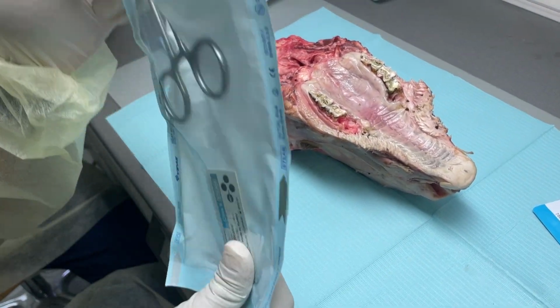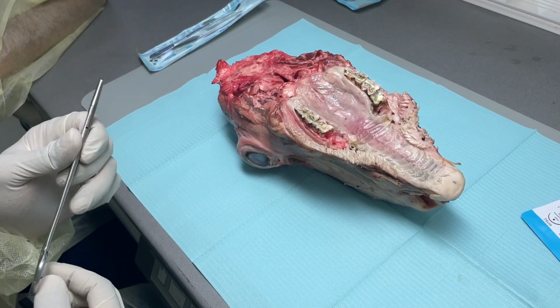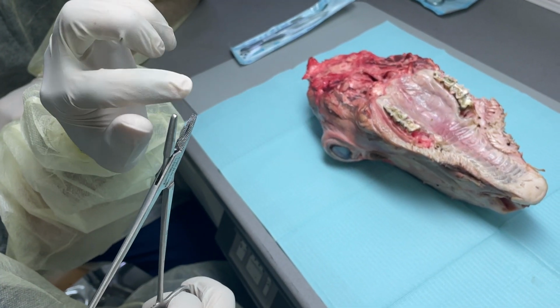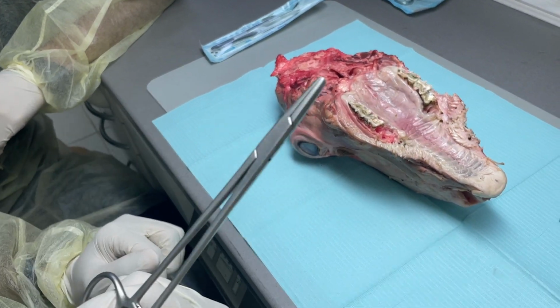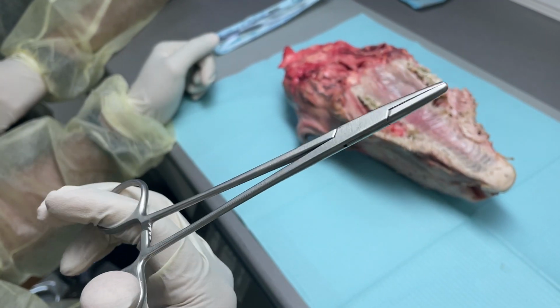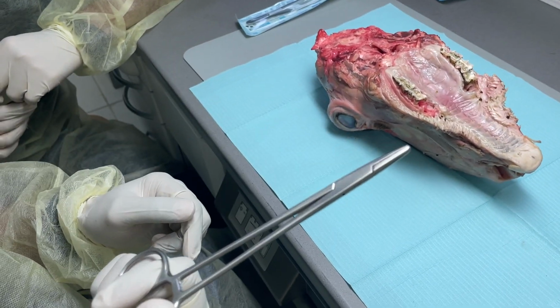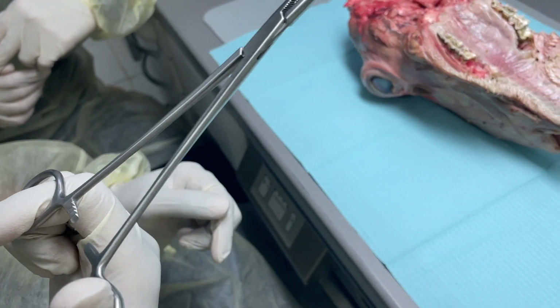So that is what we have. Needle holder. It is inside. I told you, see inside. The serrations are there for the grip. This is the ratchet lock. How do you open it? This is locked. Lift it. Press and lift it. Try.